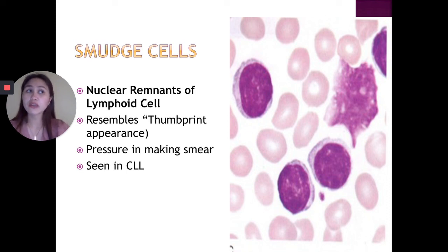You can also look for abnormal WBCs and RBCs on the internet. Just make sure you label your cells. If you can even label the parts inside the cell, that would be better, so at least you can have an idea of what abnormal blood cells can be found in the smear.